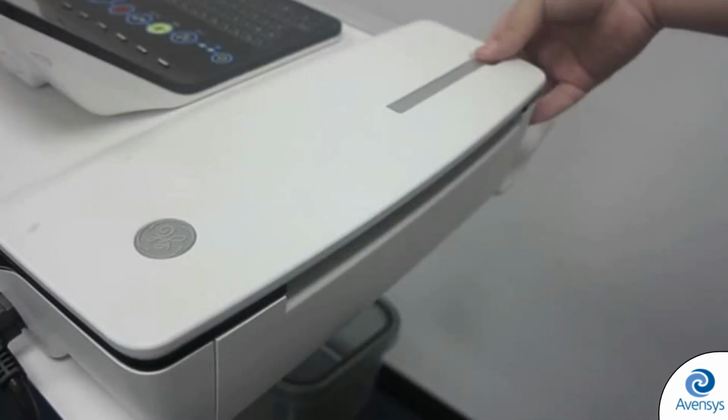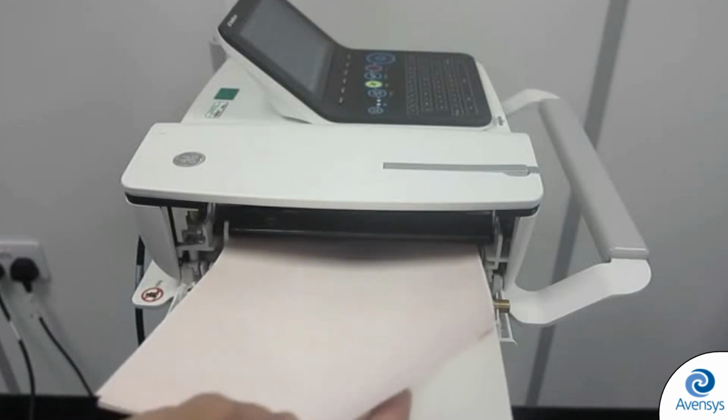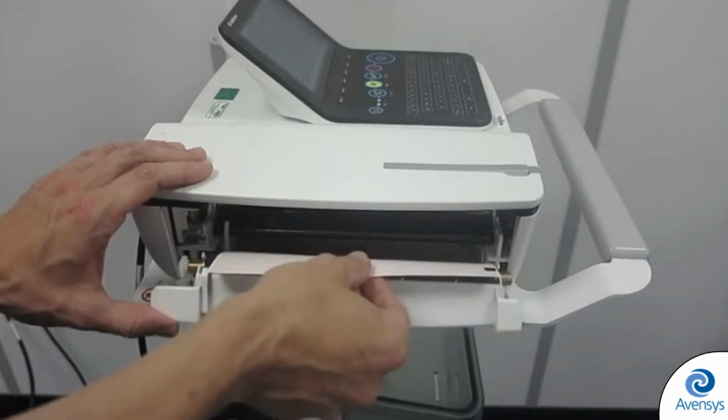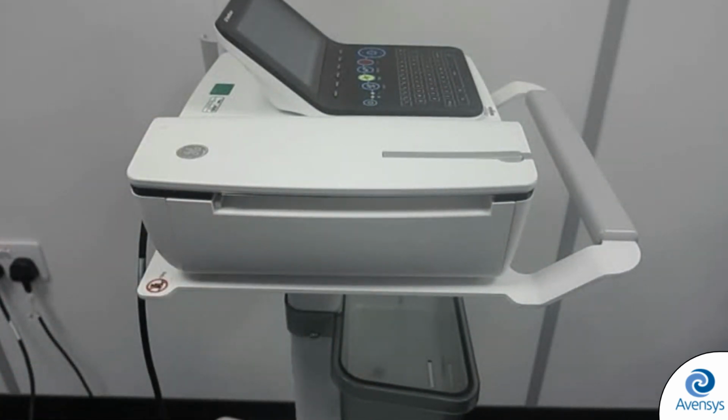To load the printing paper, press down on the silver lever on the side of the unit. The printer door will open. Slide in the new paper, making sure that the hole is at the top left corner of the paper drawer. Pull the top page of the paper over the roller and between the two indents. Then close the door.